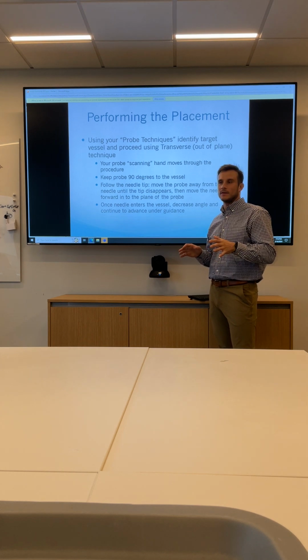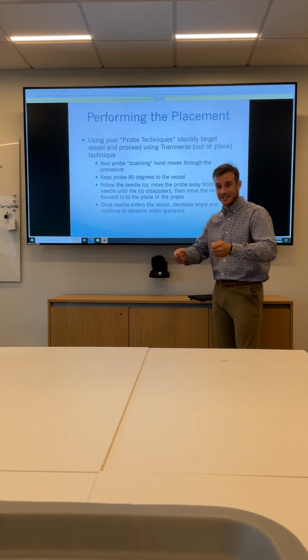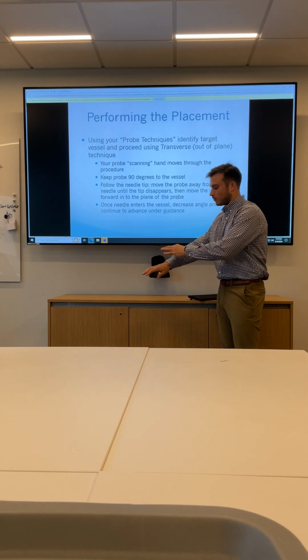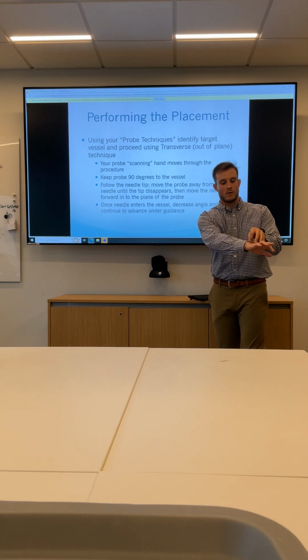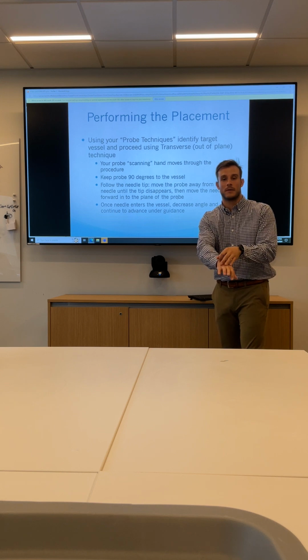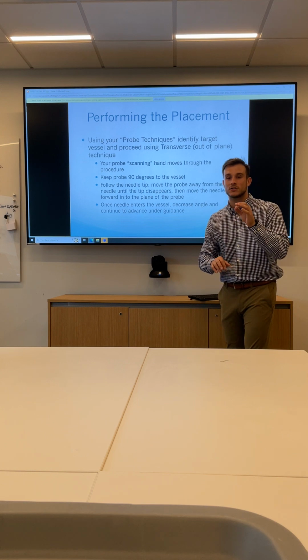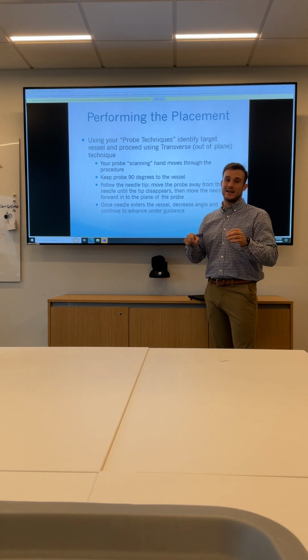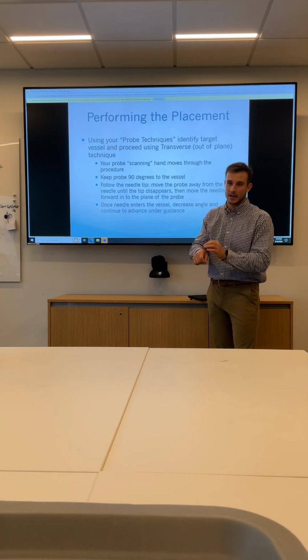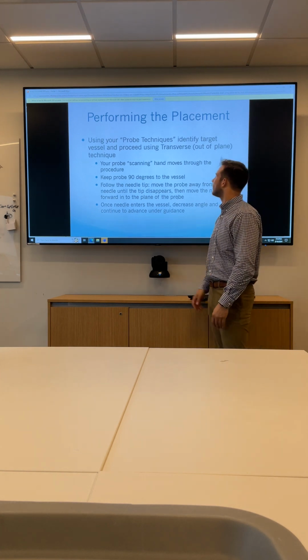One technique that I learned over the years, I call it creating the fulcrum. So drummers use their hands to create fulcrums so that their sticks bounce easier. The fulcrum here, you rest your 2 or 3 fingers on the arm of the patient, and you move with your index and pointer finger, almost like you're holding a pen or a pencil. That's the point, the fulcrum at which you're stabilizing that probe so you can do finer, small, subtle movements. It really helps getting a detailed image, and it helps find that tip and take it nice and slow. So that way you're not slipping and sliding off of the arm. It gives you that stability. Sort of like also somebody shooting pool, if any of you have experience there.